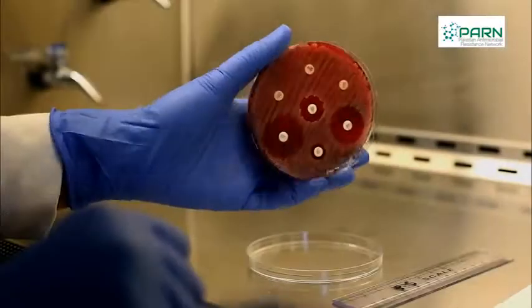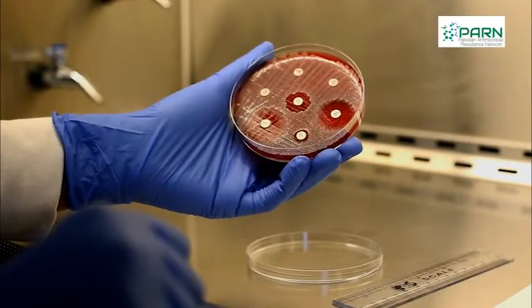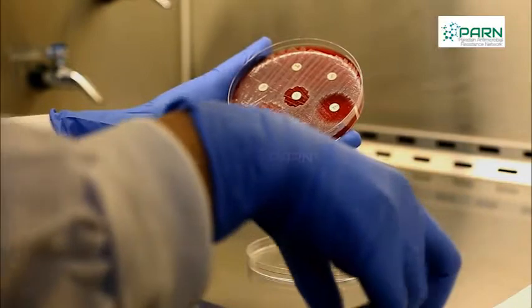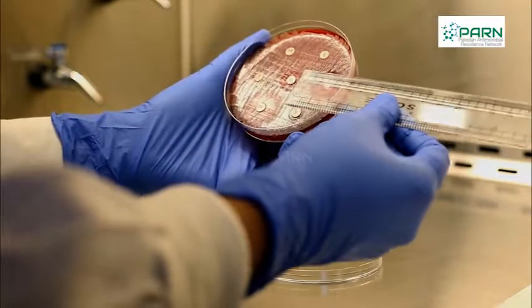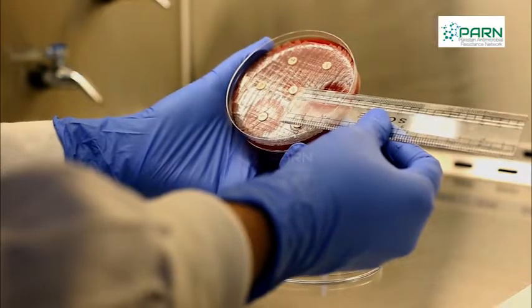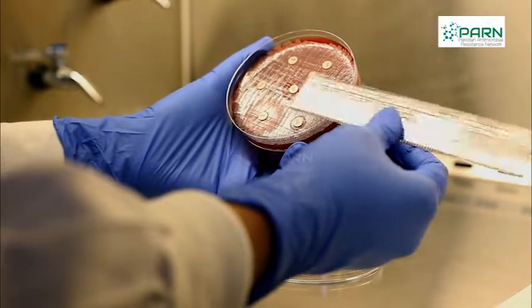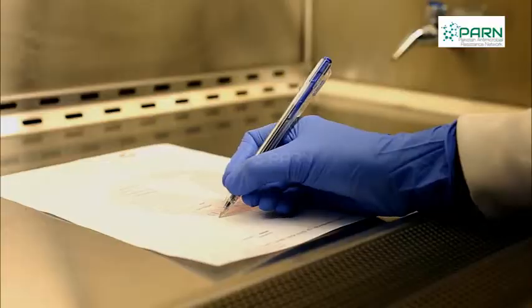Record the zone of inhibition which is the area around the disc showing no visible growth. If organism is growing up to the edges of antimicrobial discs, zone size is reported as 0 mm.